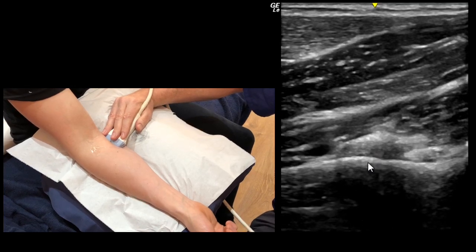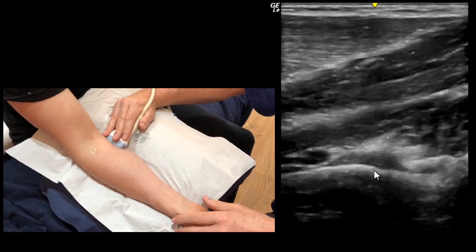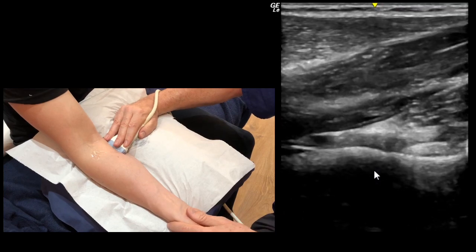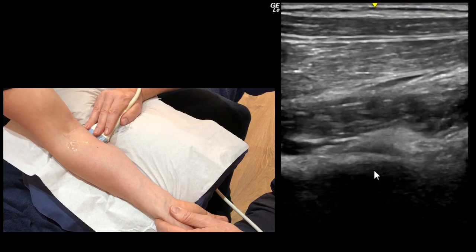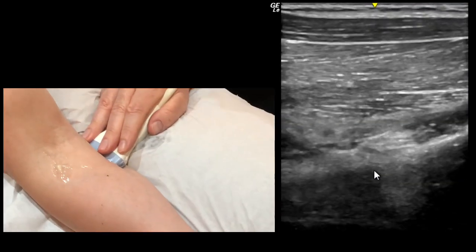You will need to push down, move the cursor out of the way, and move around a little bit further to get right to the insertion in full supination. There you see the fibres flatten out just as you lose your picture there.